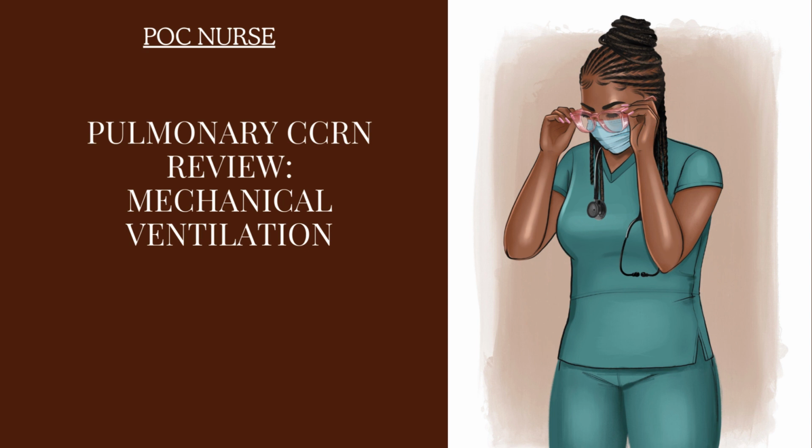If the alarms are going off and you can't figure out why, and you see that your patient is getting unstable, meaning that the patient's O2 sat is going down, you'd want to disconnect the patient from the ventilator and ventilate them with a bag valve device. Patients that are mechanically ventilated usually always have a bag valve device at the bedside by the ventilator.